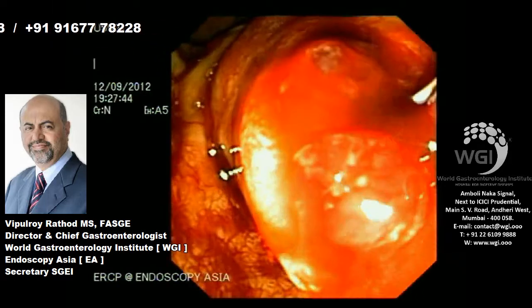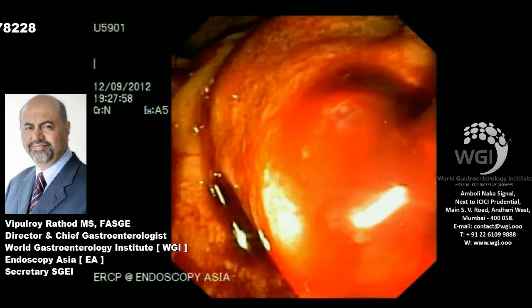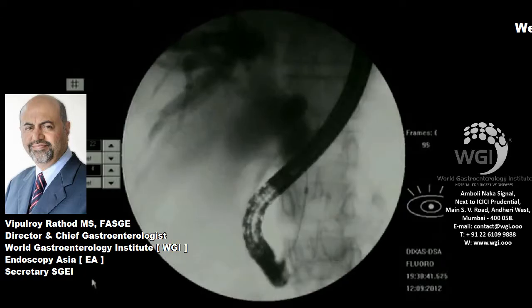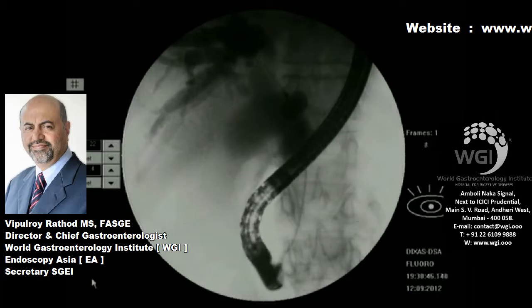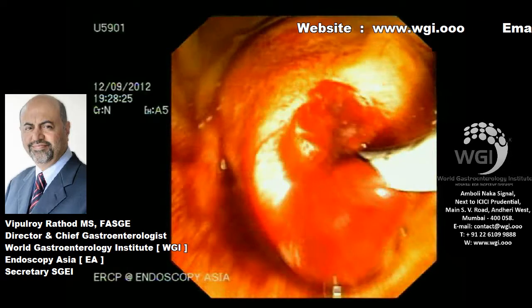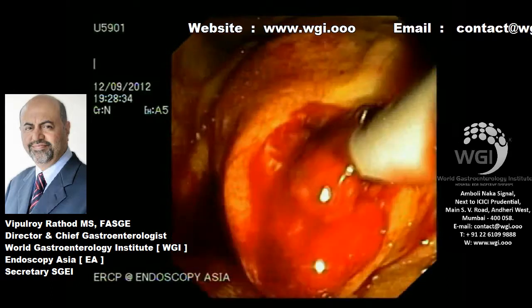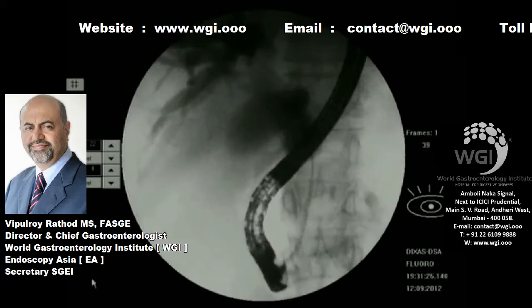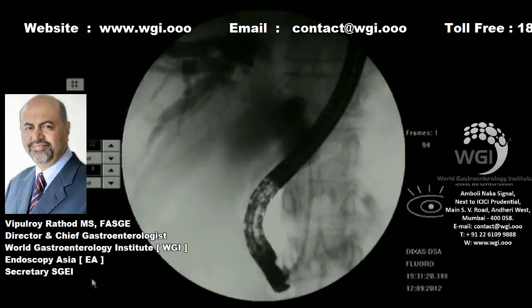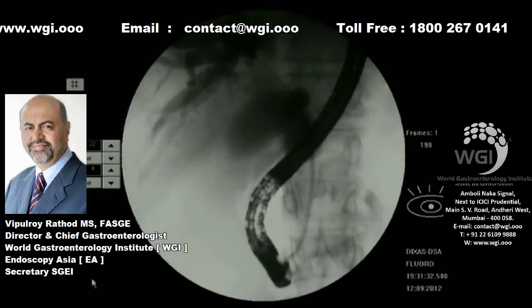this patient was requested not to place a metal stent. We feel that if there is a metastatic disease in the celiac axis region in the form of a small node, these are the patients who will benefit with a short stent, maybe a 6 centimeter uncovered self-expandable stent, and then assess resectability, and then take this patient for resection if need be, or just leave the patient alone if it's not resectable. Metal stent is anyway in the place.